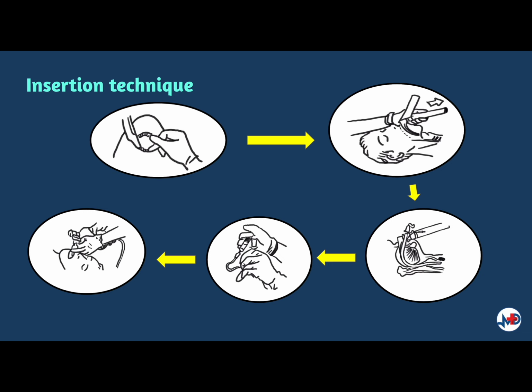Stand behind the head of the patient and open the patient's mouth and inspect. Remove any dentures or debris and suction any secretion. By holding the laryngoscope in the left hand, insert it looking down its length. Apply traction to the long axis of the laryngoscope handle. This lifts the epiglottis so that the V-shaped glottis can be seen.